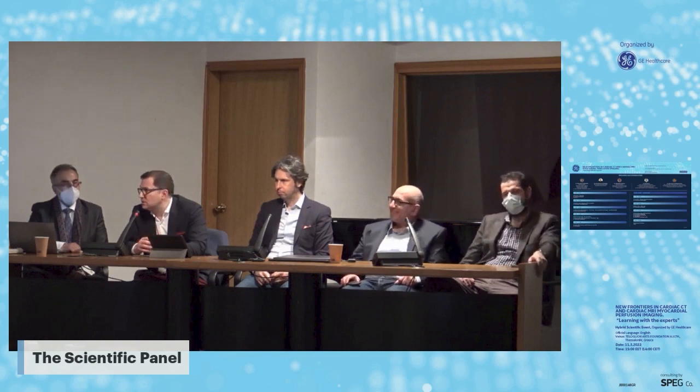I think stress MRI is a fantastic one-stop shop. Some people would say it's too expensive, but I think there are a lot of costs of unneeded bypass surgeries, expensive CTOs of the coronary arteries, and so on, and of course a lot of radiation exposure and contrast exposure that we can avoid with the use of stress MRI. And in the modern era of complex interventions, it's very important to assess first the viability and the ischemia before proceeding to complex cardiac and coronary interventions.